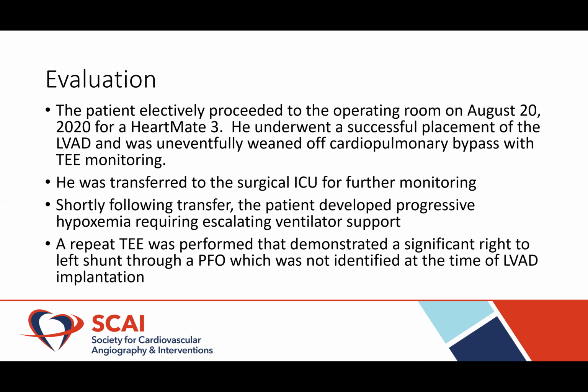So the patient was electively admitted and went to the operating room on August 20th of this year. He underwent a successful HeartMate 3 implantation, was overall weaned off of cardiopulmonary bypass without any complications, and had TEE monitoring throughout the entire procedure. He was transferred to the surgical intensive care unit for ongoing care.